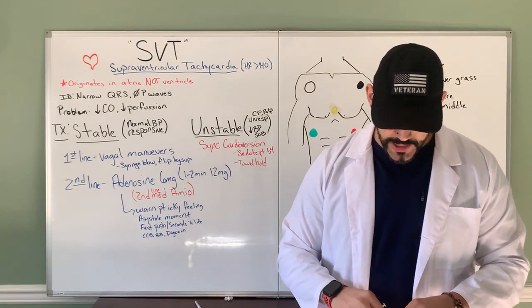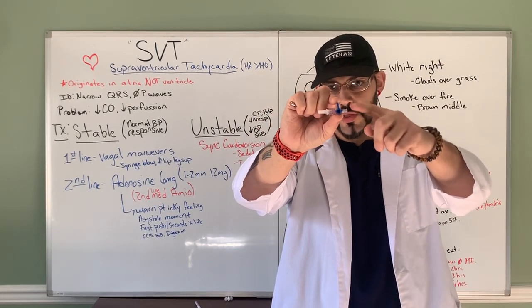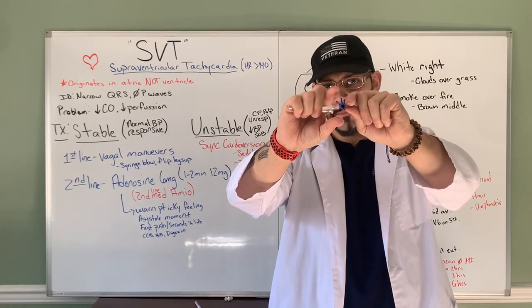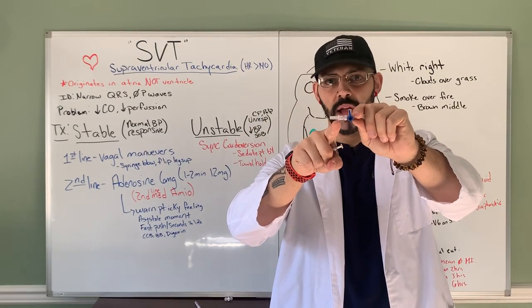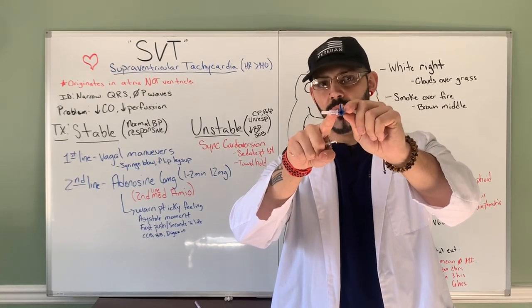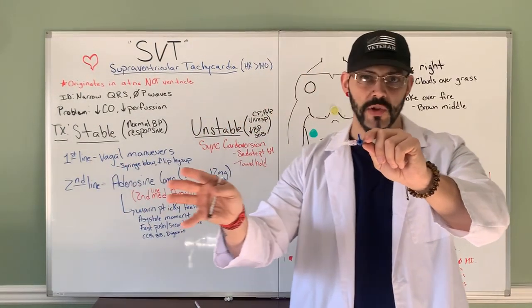We're gonna use this handy dandy stopcock right here. Okay, you may have seen it. It has the 2 chambers where the medication and the saline syringe are gonna go. And then this will be the tubing that goes to your patients, okay? It should be straight to the J loop, all right? We're not putting this on some long tubing. This is going straight to the J loop, straight to the IV, all right? No additional tubing necessary. It's gonna cause the adenosine to lose its potency way before it reaches the heart, okay?